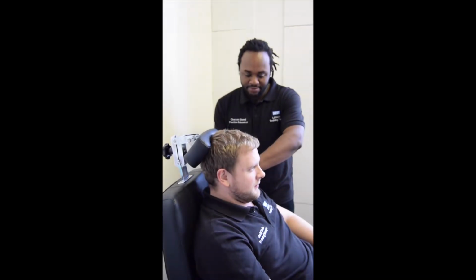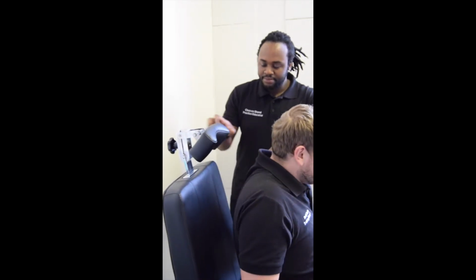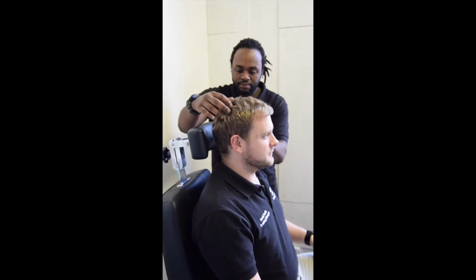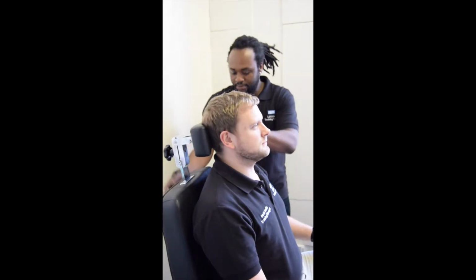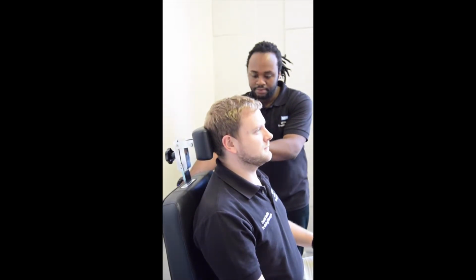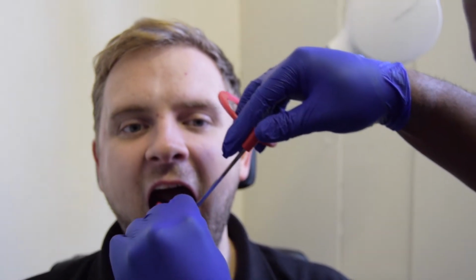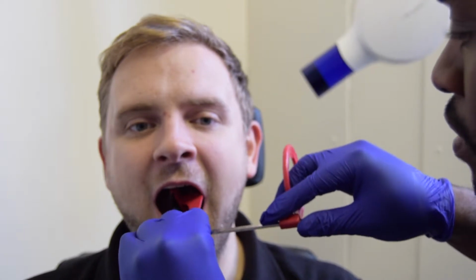So for intraoral radiography, the patient should be positioned comfortably in a dental chair, ideally with the occlusal plane horizontal and parallel to the floor. For most projections, the head should be supported against the chair to minimize unwanted movement, to avoid repeat investigation, and to lessen patient discomfort. The patient should always be watched throughout the exposure to check that he or she has followed instructions and not moved.